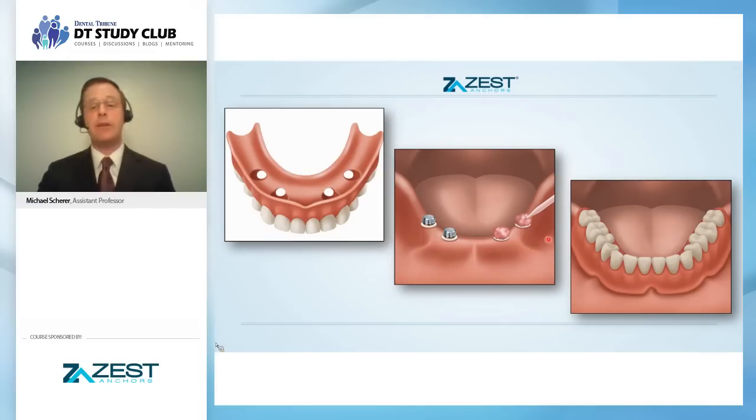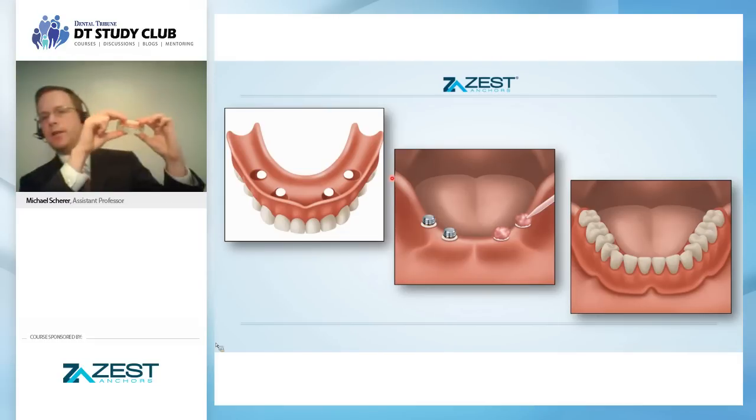Now, one thing I will definitely depart from is some of the manuals that you'll see from Zest Anchors. This is a little clinical pointer and tip. I place the denture in place with the resin in this reservoir, and I hold the denture in place. So instead of having the patient bite down, all I do is I grab their mandible on each side, and I lightly hold the denture in place, just like this, as you see here.